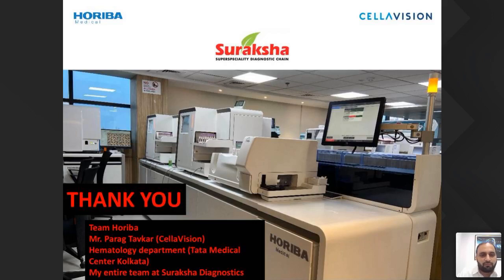Well, this is my lab, the Helos platform, with two CBC analyzers, one for reticulocyte count and other CBC parameters, the other giving me only CBC. So with a workload of more than 500 samples per day, both of these continuously run for 8 hours or so. Then we have this automated track system with the slide preparing and staining system. We get good quality slides with good stain. All this is put into the CellaVision and I get the report at my desk, where I can look into everything and verify.